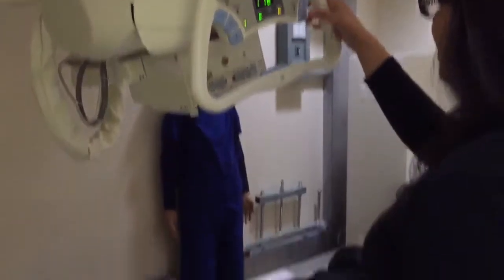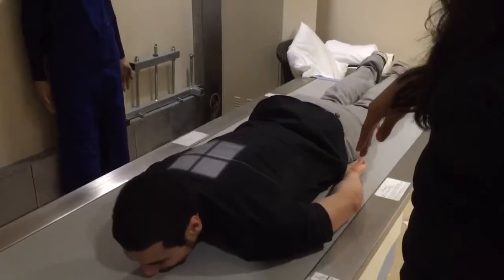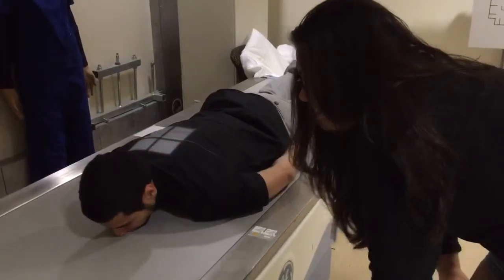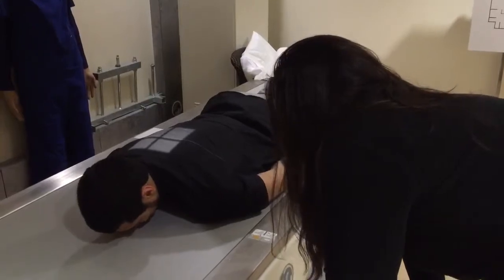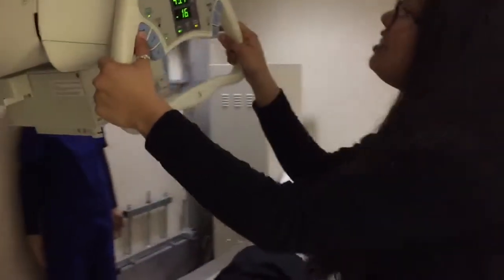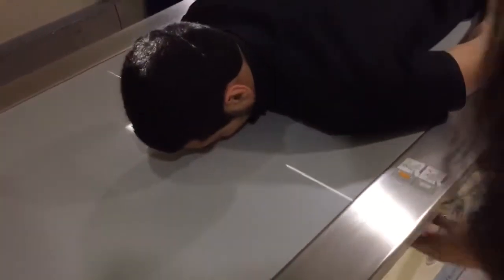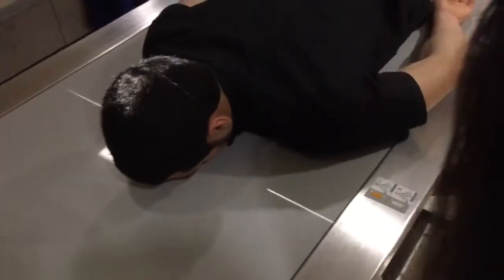Am I supposed to lay this way? Face flat. Alright. And we want the OML to be perpendicular to the IR, so all the way flat. There we go. Next, we have to make sure the CR exits at the nasion. Right there. And the Bucky is aligned to get the picture.